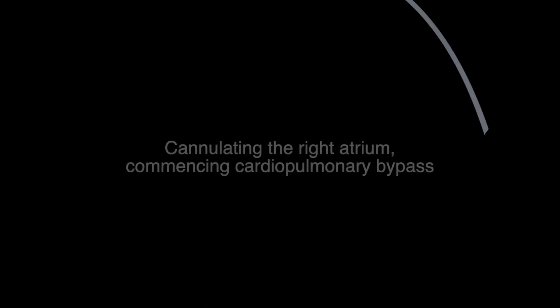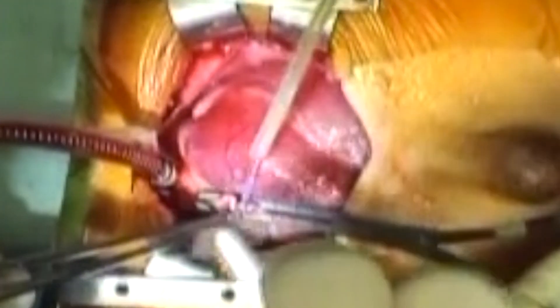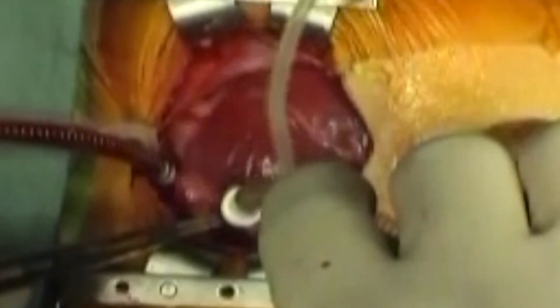The remainder of the arterial limb of the circuit is similarly secured to the surgical drapes to prevent kinking. The side biting clamp is placed once more in its old position across the base of the right atrial appendage. The purse string is released and the tip of the cannula is gently placed through the right atrial appendage opening as the clamp is released.